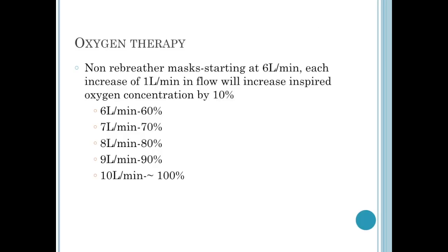On this slide, you can see, when we switch over to a non-rebreather mask, what the percentage of oxygen delivery is. You may want to clip this slide and the other slide regarding nasal cannula flow, cut it out, put it in that peripheral brain.